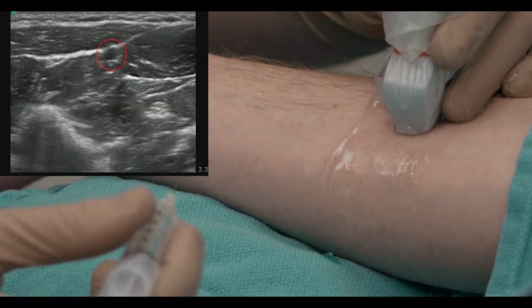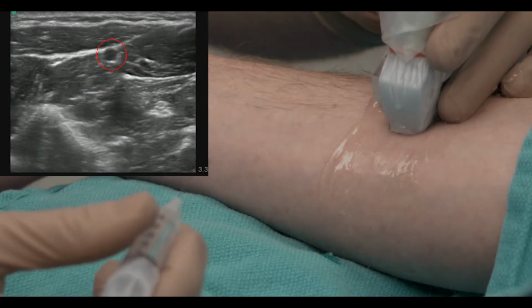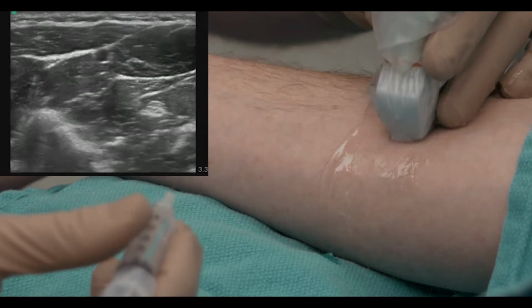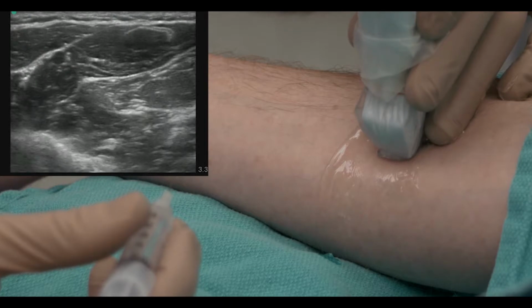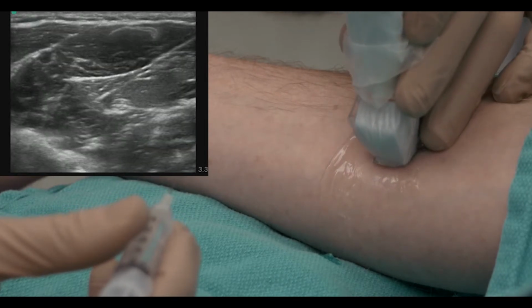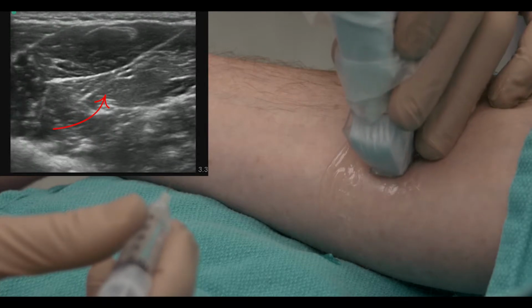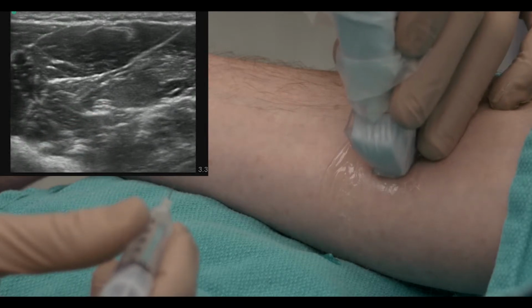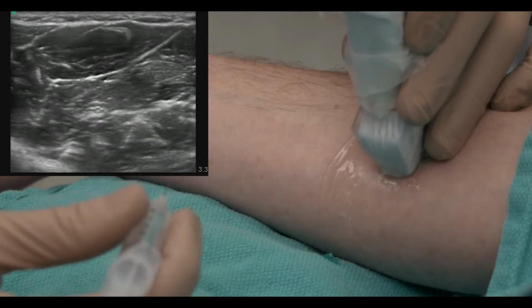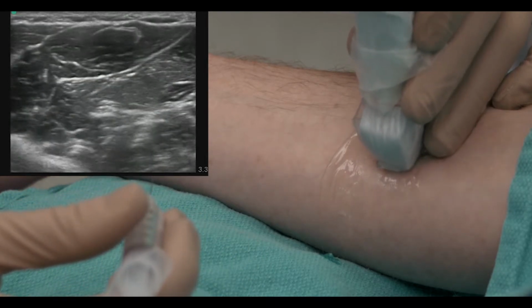If we look here at the video, we can see the radial artery sitting in the middle of our screen. From there, to find the median nerve, we're going to slide towards the middle of the forearm. If we look down at about a 45-degree angle, we'll see the median nerve sitting right in the middle of the screen. We can identify the median nerve by the anisotropy that we spoke about earlier. So it's reflective, it has that honeycomb type look.